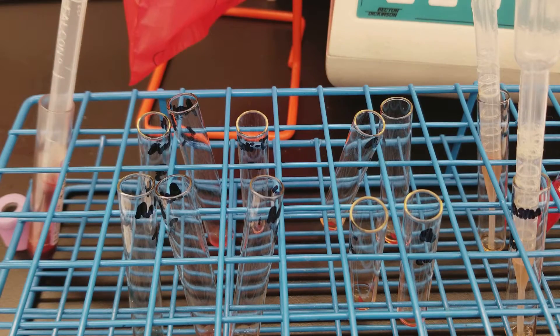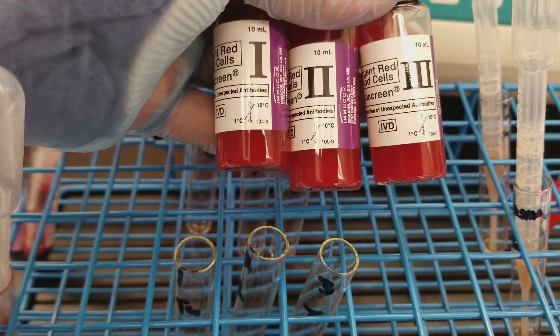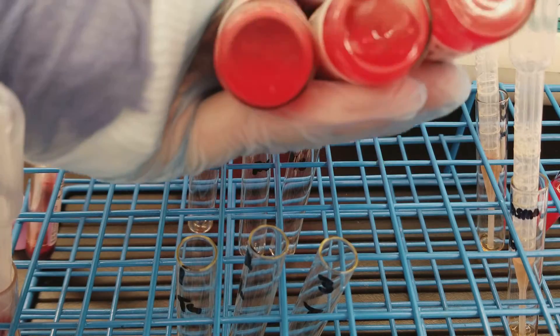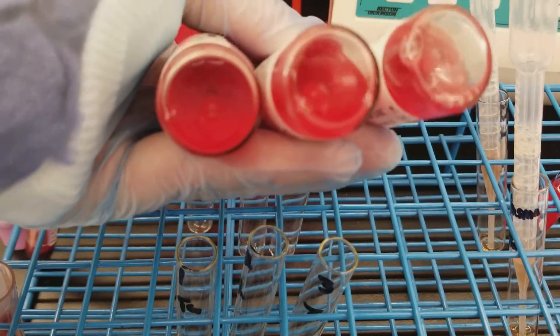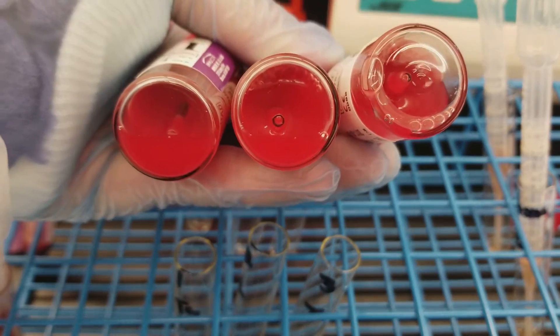I recorded them and now I'm going to move on to the screen. The antibody screen has three panel cells of O donors. You need to make sure to gently mix the reagent cells so that there aren't any sticking on the bottom, which you would see if it had sat there for a while. We will put reagent red cells into each of our patients.